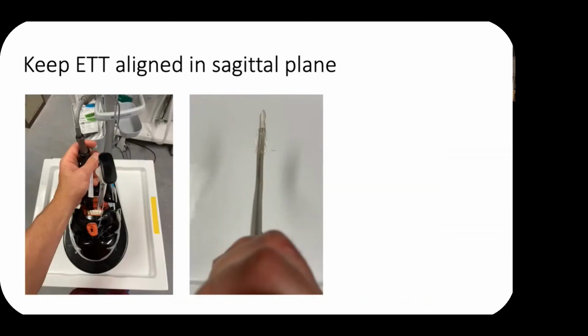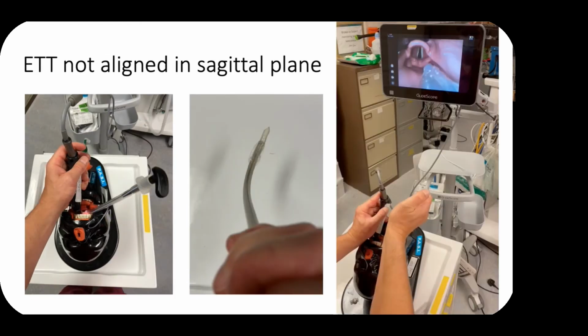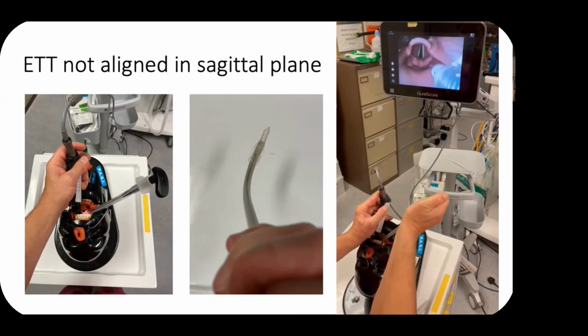I would also recommend trying to keep the endotracheal tube in a sagittal plane. Not uncommonly, I see people with the tube in this position, angled off to one side, and they often poke around the arytenoids as a result, and it is only when the endotracheal tube is brought into a sagittal plane alignment that they can then reach the cords. This can be seen on this video and also a real life one I'll show later.